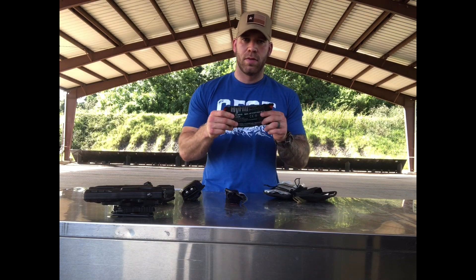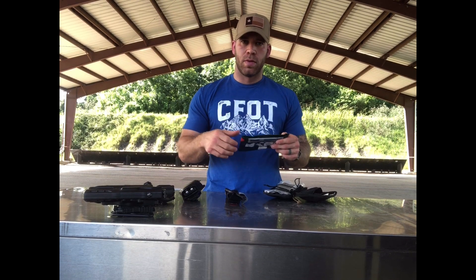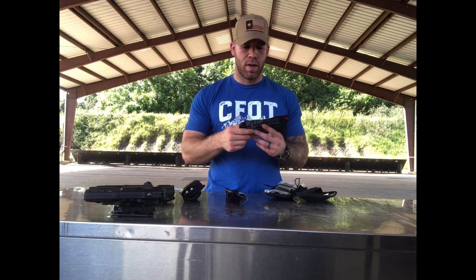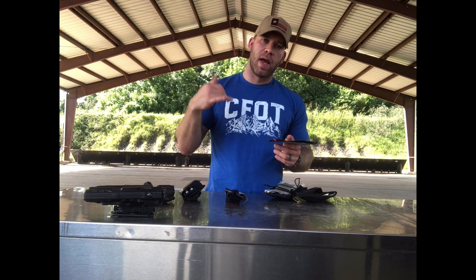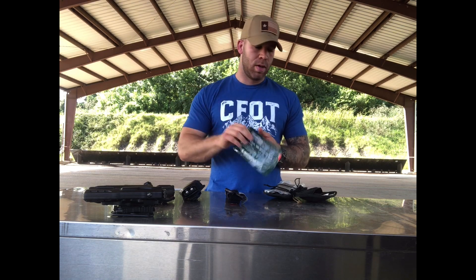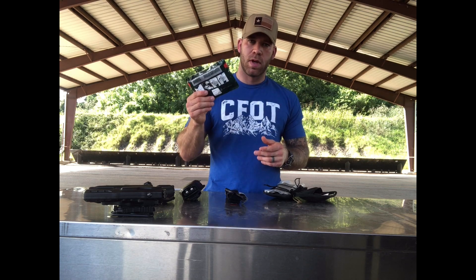Next you're going to have a chest seal. Any penetrating trauma to the chest — chin to navel — you're going to throw a chest seal on. The only thing I would say is it would be nice to have two in the kit. Of course there's room to throw another one in should you choose to do so. We know that if we have an entrance wound, it's possible we're going to have an exit wound on the other side. Throwing two in there would be a good idea, but there's at least one in there. Anything we call 'holes in the box,' you want to cover with a chest seal.